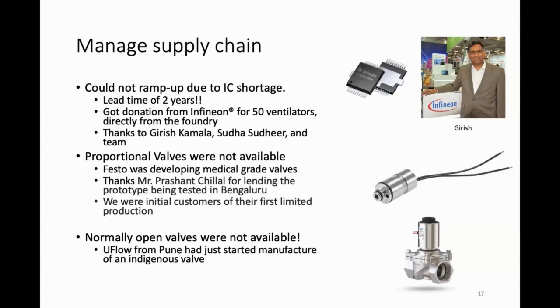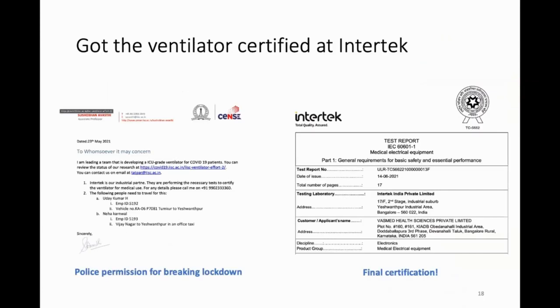UFlow is an Indian company. They were indigenizing it at that point in time. They were actually supplying these valves to the BL ventilator. And after the BL ventilator, I think they were the second customers. So all of these things become important when you're making that productionized version.